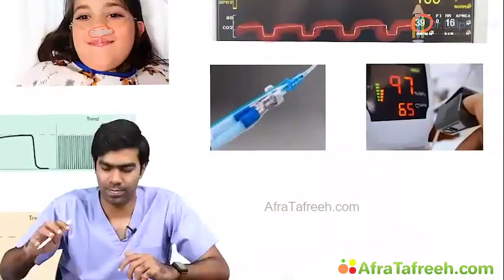That's why there is maybe a little delay in the carbon dioxide detection in the CO2 detector. So that's again a very important curve. You can see during expiration, the pressure curves will become flat, but the EtCO2 curves will start rising. But during inspiration, the pressure curves in the ventilator will start rising, but the EtCO2 curves will become flat. So it's something like a reverse that you have to understand.